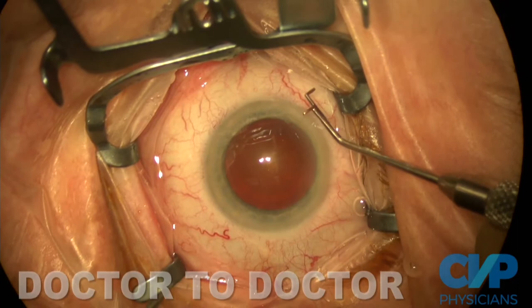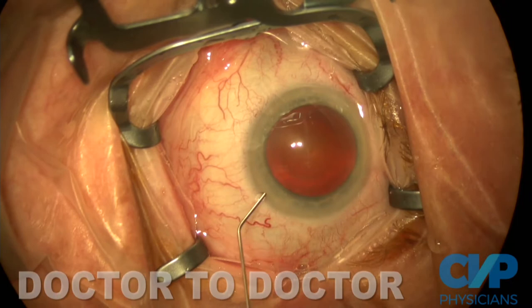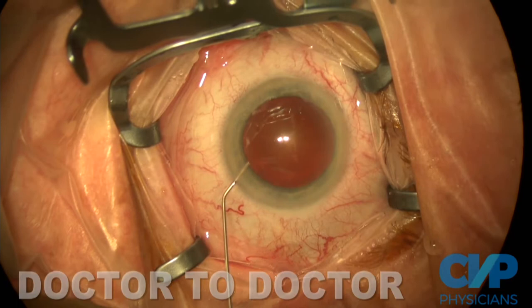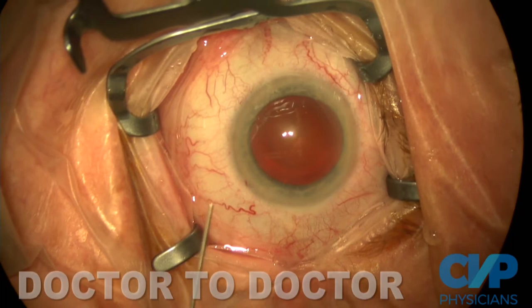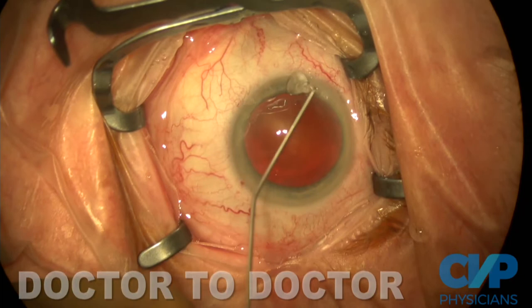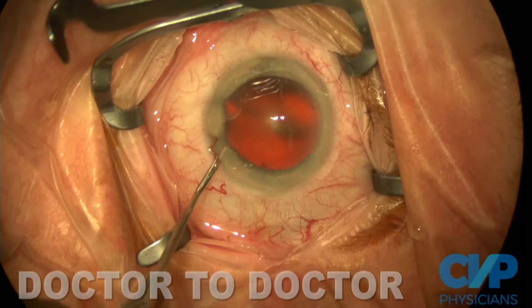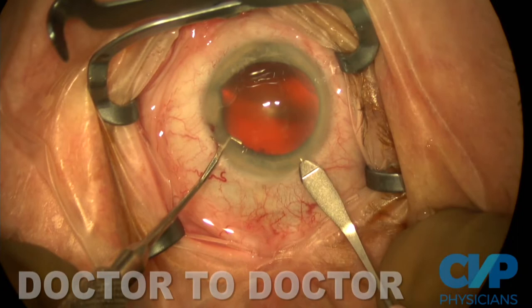Like most people, I start my cataract surgery with a paracentesis. I'm right-handed, so I make a left-handed paracentesis for my second instrument. I use 1% preservative-free lidocaine to anesthetize the ocular surface, and also intracamerally to provide additional anesthetic. My preferred viscoelastic is DuoVisc, so I'm injecting Viscoat into the anterior chamber to protect the endothelium and stabilize anterior segment structures. I also use it to coat the ocular surface to keep the eye from desiccating and mitigate the need for the technician to constantly be irrigating.